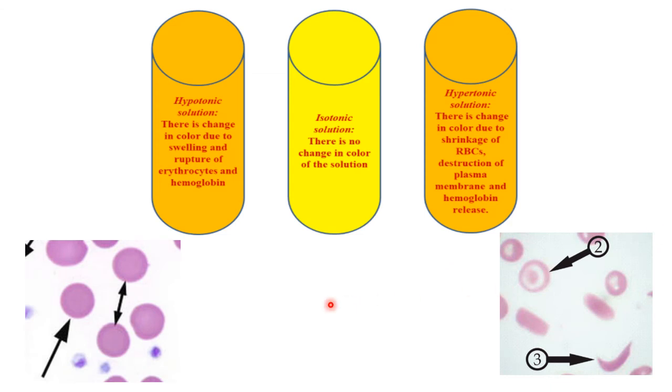So, para ma-visualize natin, no? Compare natin hypotonic, iso, and hypertonic. Kapag hypotonic, una muna magsiswell and then mag-rupture. So, ito yung swelling of the RBC. Hindi mo na ma-appreciate yung kanyang donut shape, no? Yung central pallor niya. As compared to the hypertonic, shrink lang niya yung mga RBC. Okay? And then, therefore, yung ating plasma membrane may release after the shrinkage. So, much better to test for the membrane is through hypotonic solutions.